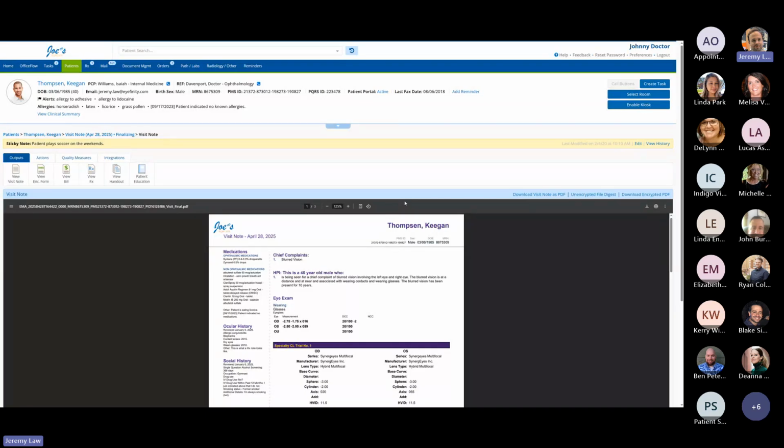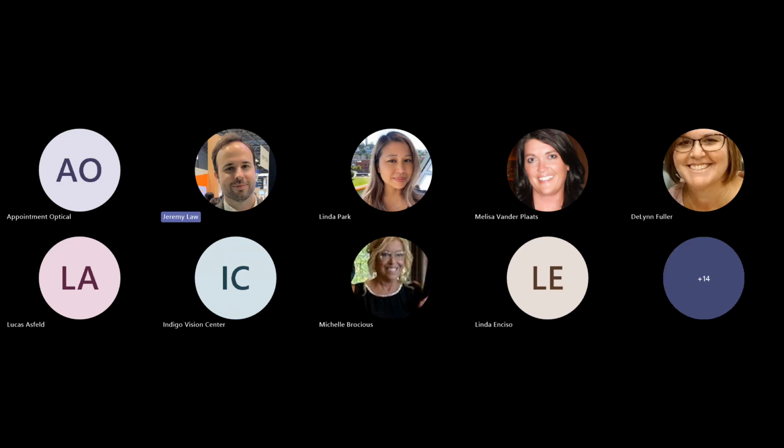So I'm going to go ahead and pivot away from the web application, since I mentioned we were going to take a look at the iPad app. Give me just a second to bring that up. It'll take me about 30 seconds.